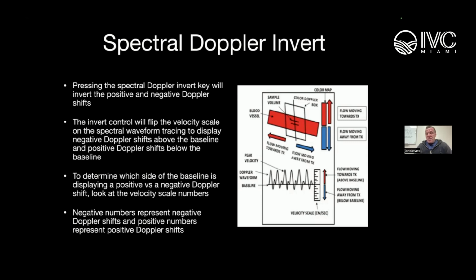Because ultimately, you want your color information and your spectral Doppler information to be in the same direction of what it is you're doing. I mean, that's an important piece, right? And so that's really the point here when you're doing this.